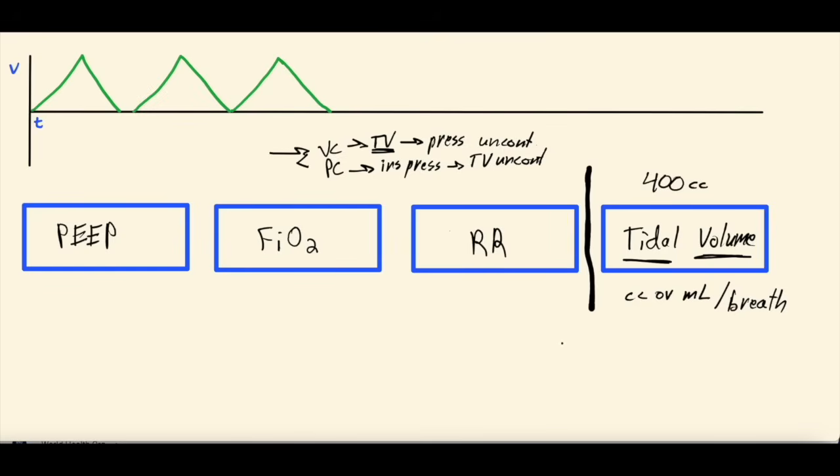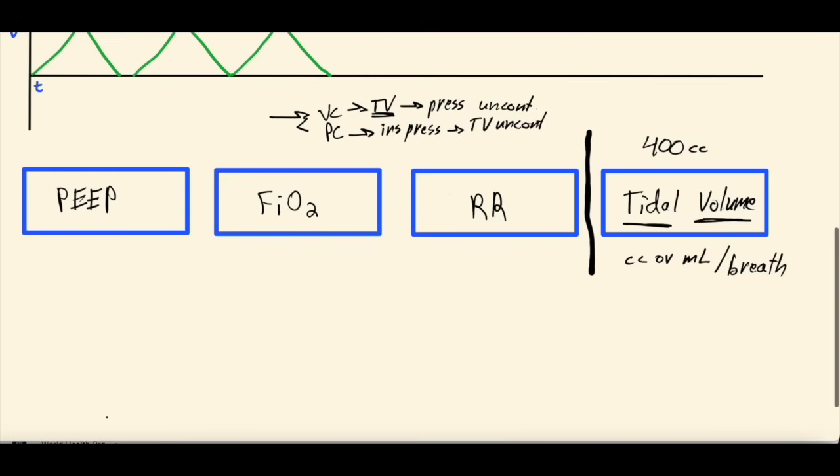So when we're talking about volume control, you're going to see the front of a ventilator. So let's say you got a patient here, stick figure human, and they are intubated, unfortunately. They have bad pneumonia, so they have a breathing tube coming out of their mouth, and that breathing tube is hooked up to a ventilator, and you have the ventilator screen.